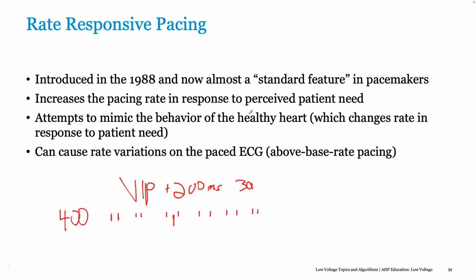Yeah, thanks, Jared. Pleasure, guys. Yes, the Sphera we get in Nigeria has the Search AV feature, but does not have the MVP or the AAI mode. Yeah, but the point is, Elvis, AAI to DDD does what you want.